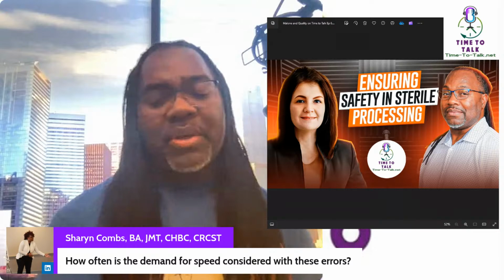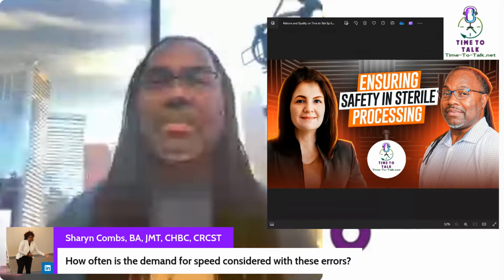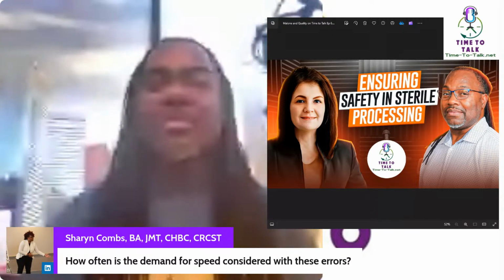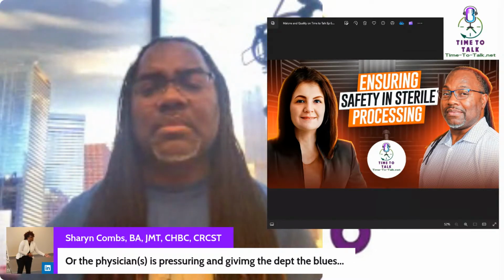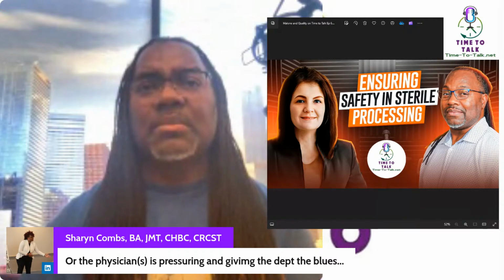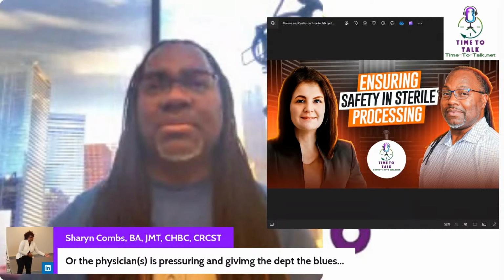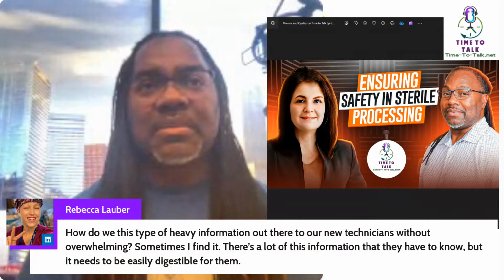So we had a benchmarking list. We had, say, 10 items that we were tracking, and that's what we used. It was missing indicators, bioburden in the tray, foreign objects in the tray. There was a list. So if you got hit with one of those items, it went on your calendar, and I think it was 3 errors a month that would necessitate a write-up. So 3 errors a month would be the threshold for somebody actually getting written up for their quality. But again, it depends on what the facility wants.